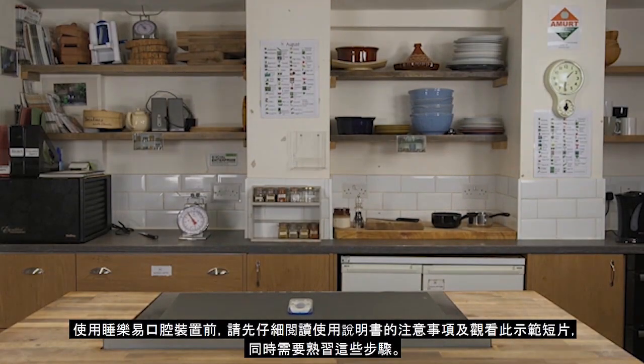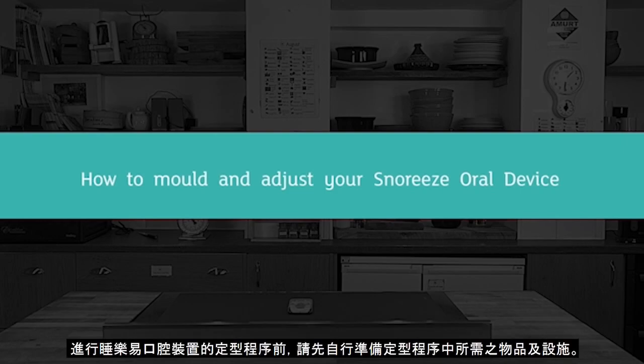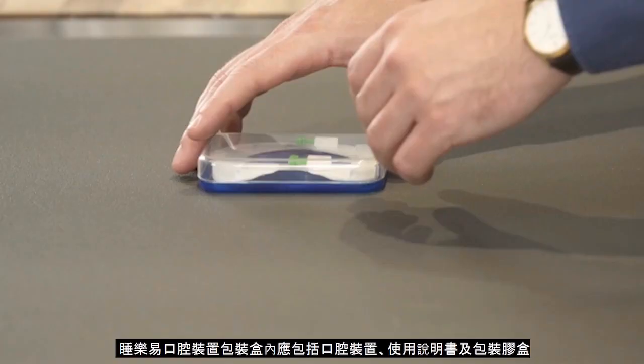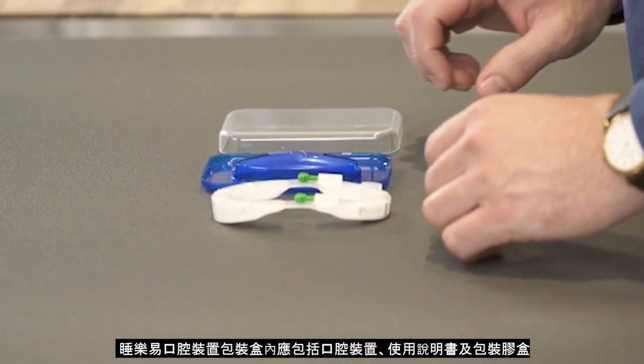Please watch this video and familiarise yourself with instructions before attempting to mould your Snoreeze Oral Device. Before moulding, make sure you have everything needed for the fitting process. In the Snoreeze Oral Device box there should be an oral device case, with your new oral device inside and an instruction leaflet.